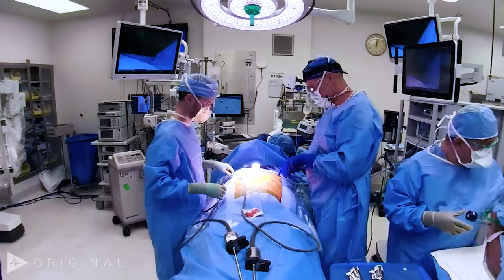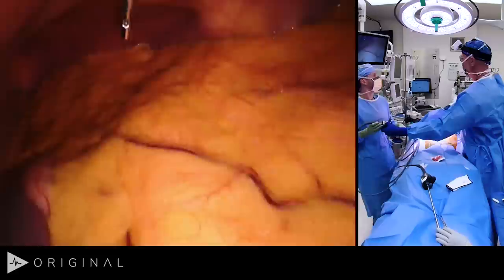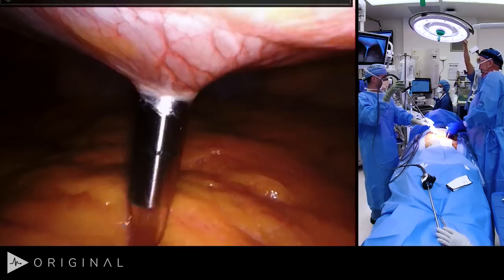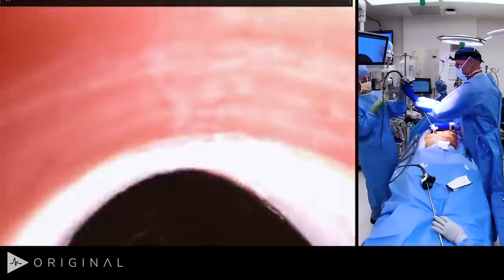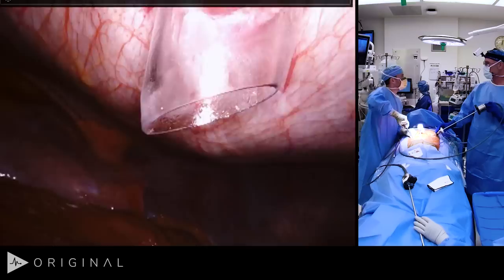We hook gas up to this port and use the 30-degree scope to first look at the Veress needle entry site — no injury to the underlying viscera. We withdraw the Veress needle and proceed. As we place these ports, we adjust the remote center: there's a thin black line and a thick black line — the thick black line is the remote center, which has to be at the fascia. My assistant puts in his 8mm port, we adjust depth, and port-hop to complete placement.